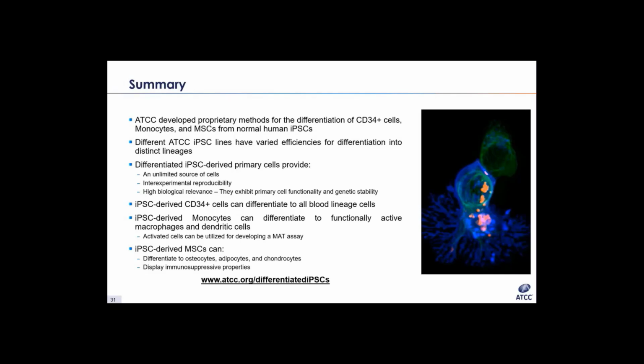In addition, actually, the optimal seeding densities are critical for differentiation. So we do have suggested seeding densities in the differentiation media kits for osteocytes and for chondrocyte and adipocyte differentiation kits that we provide.